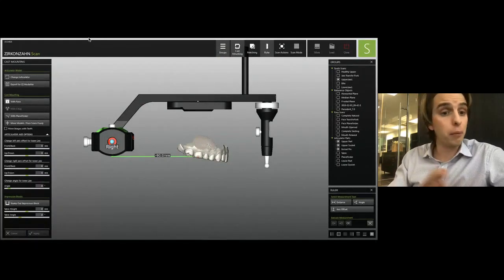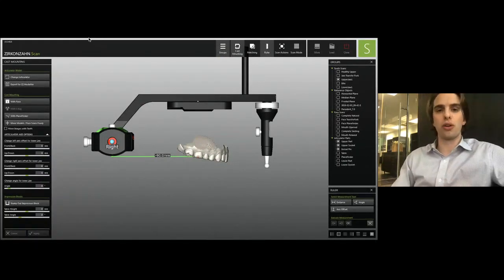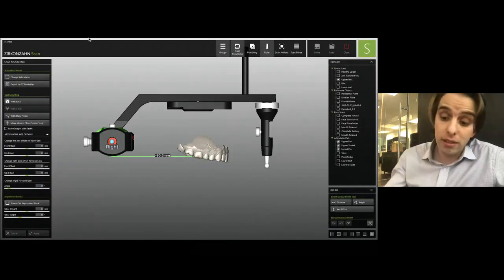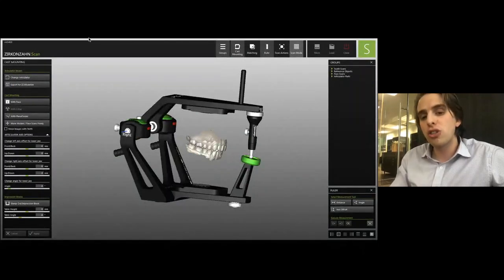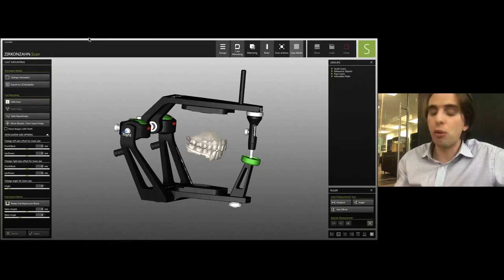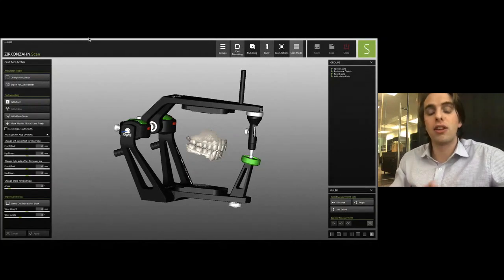The lower jaw we bring in, as I showed you in the first two courses, by means of a fine adjust scan, a bite scan, and we will position the lower jaw in relation to the upper jaw through whatever clinical recordings, whether you want to start with a CO or a CR mount, that is your business.